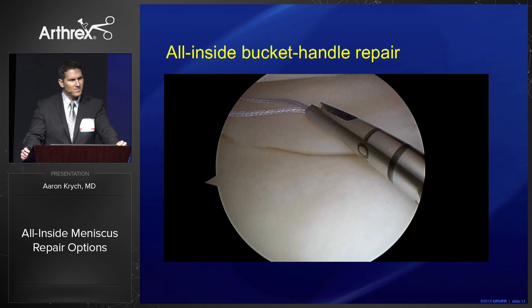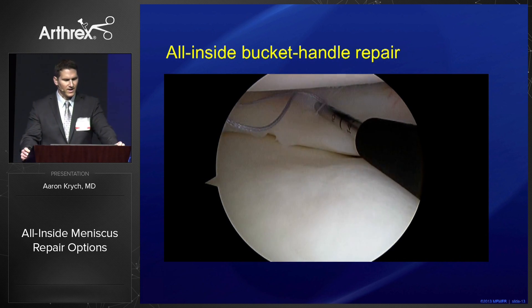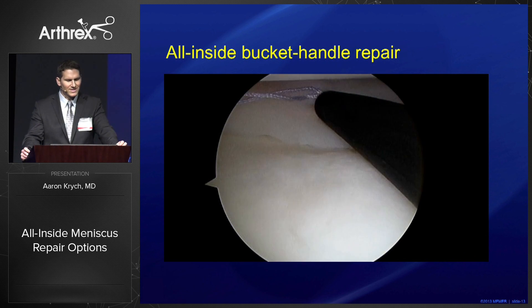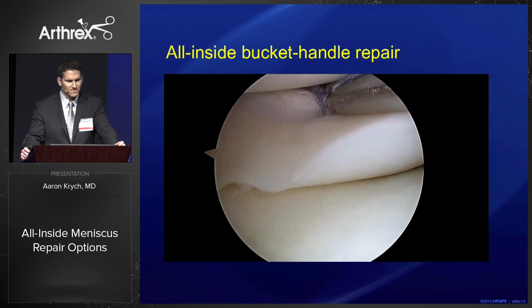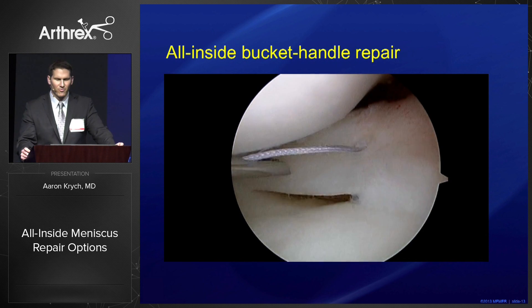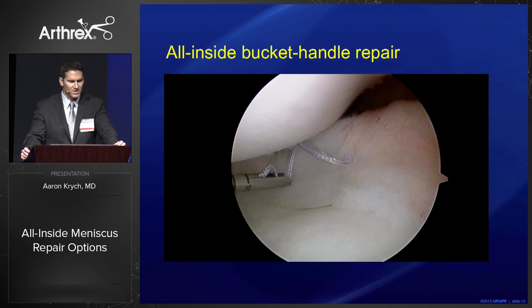Your first stitch is your absolute most important stitch for anatomic reduction. Here we use a vertical mattress stitch for a vertical longitudinal tear, and then we use our knot pusher cutter to really dial in the amount of tension we want — we don't want to over-tension these repairs. Then we move into that danger zone, where rather than performing a vertical mattress suture, I like to form a horizontal mattress suture, which showcases the versatility of the Speed Cinch.